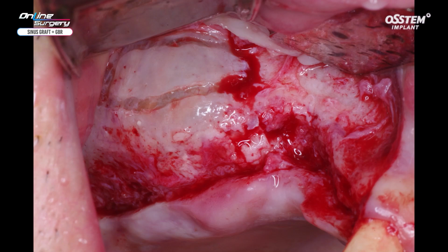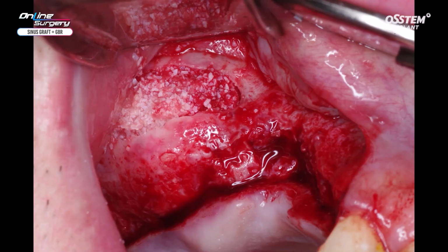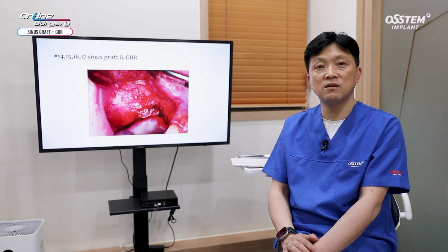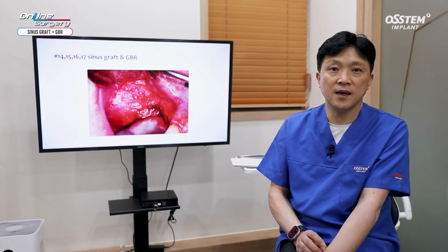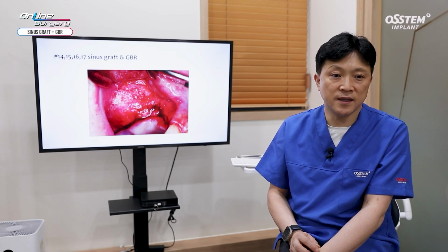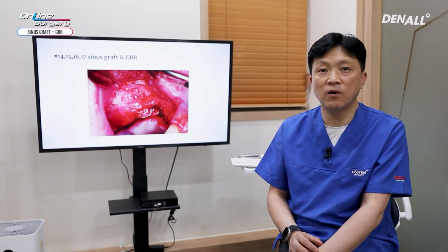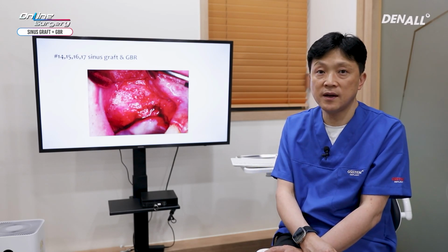After performing osteotomy, out-fracture of the window was done and the sinus membrane was elevated. I used EOS collagen for sinus grafting. I've been using EOS collagen continuously. I don't think there will be any problem in considering the EOS collagen as the same as particulated bone graft. I've applied it in the sinus.